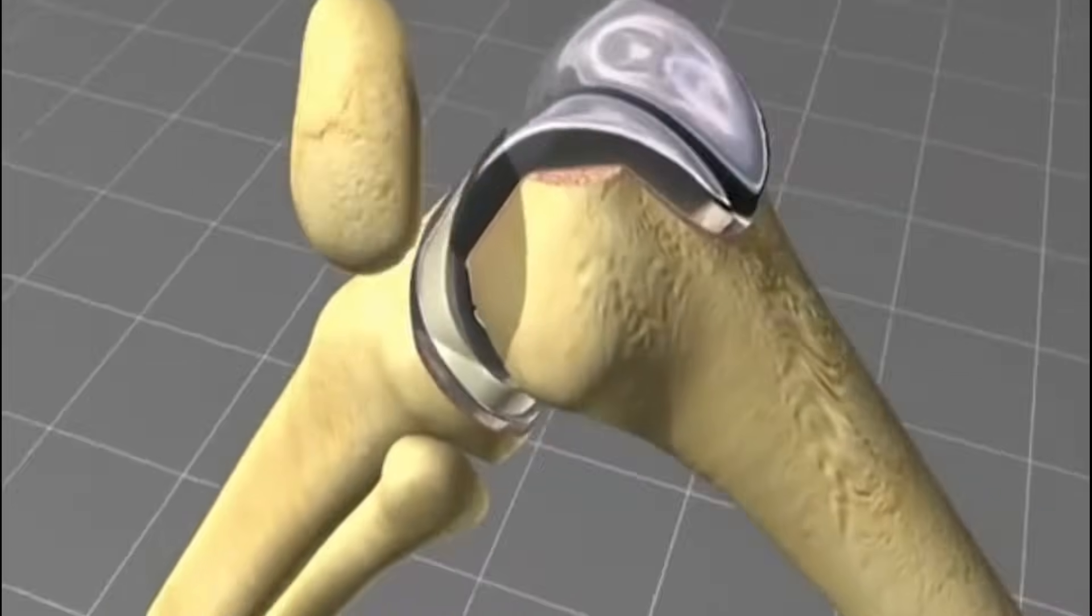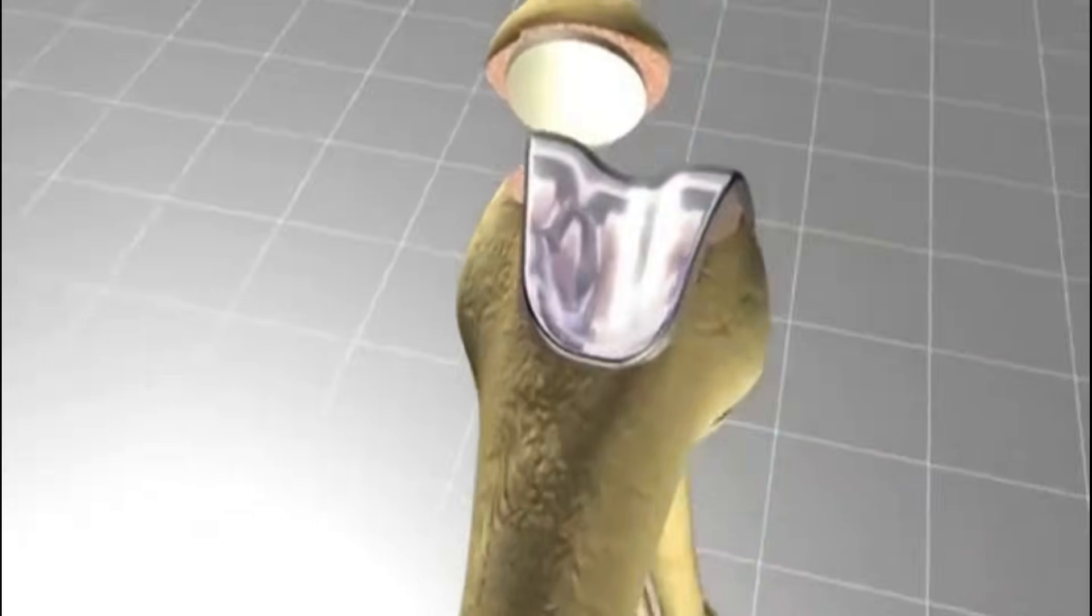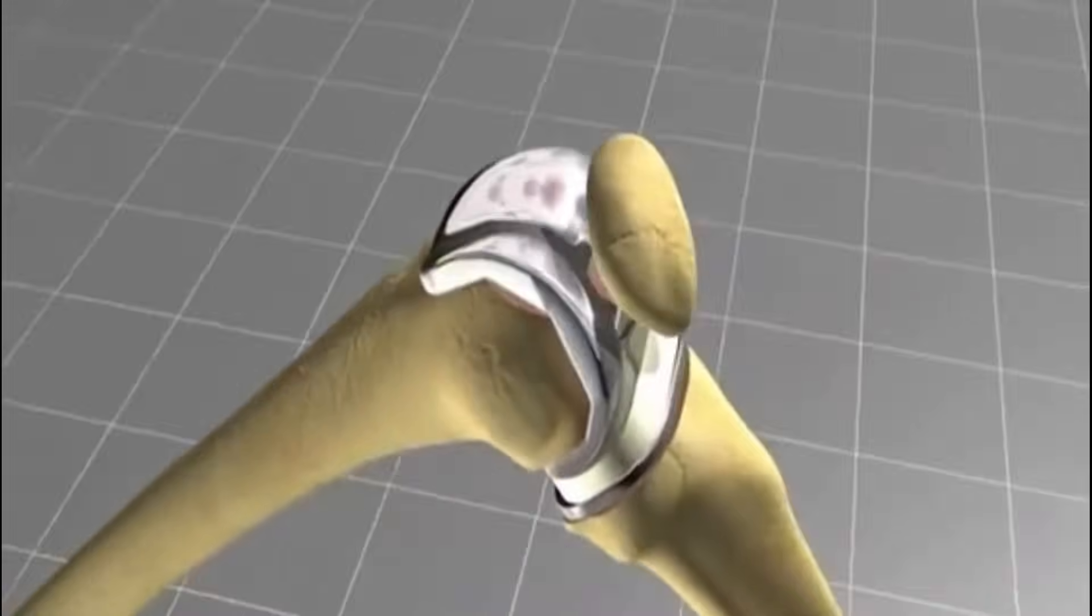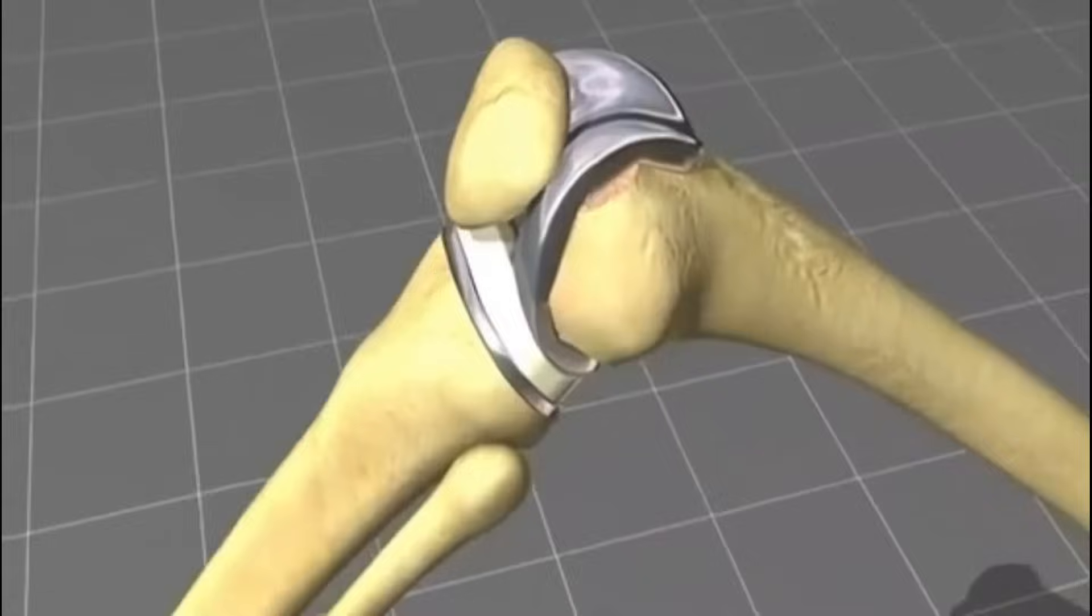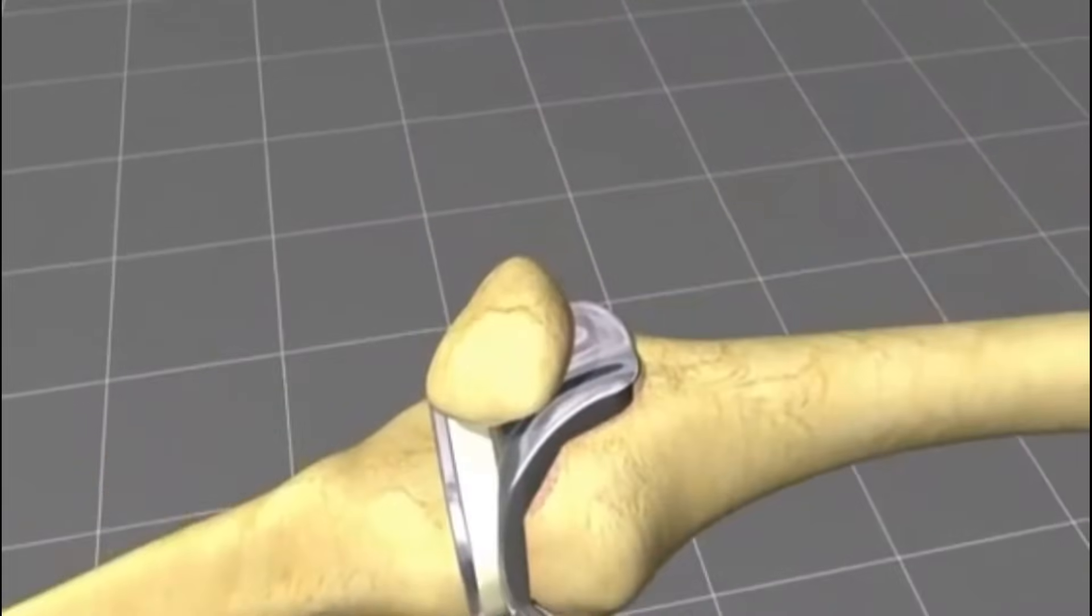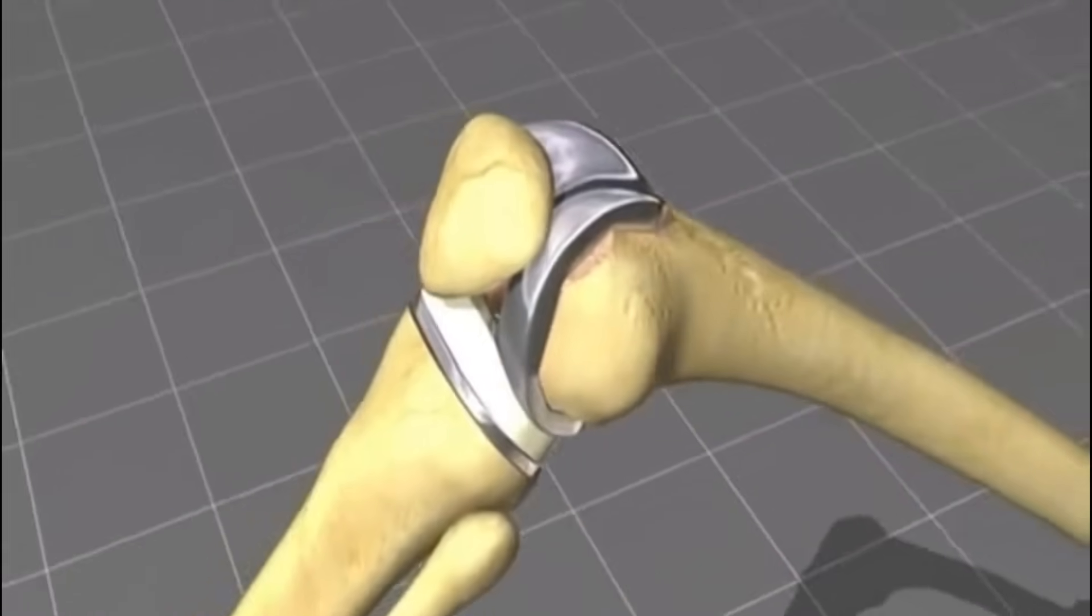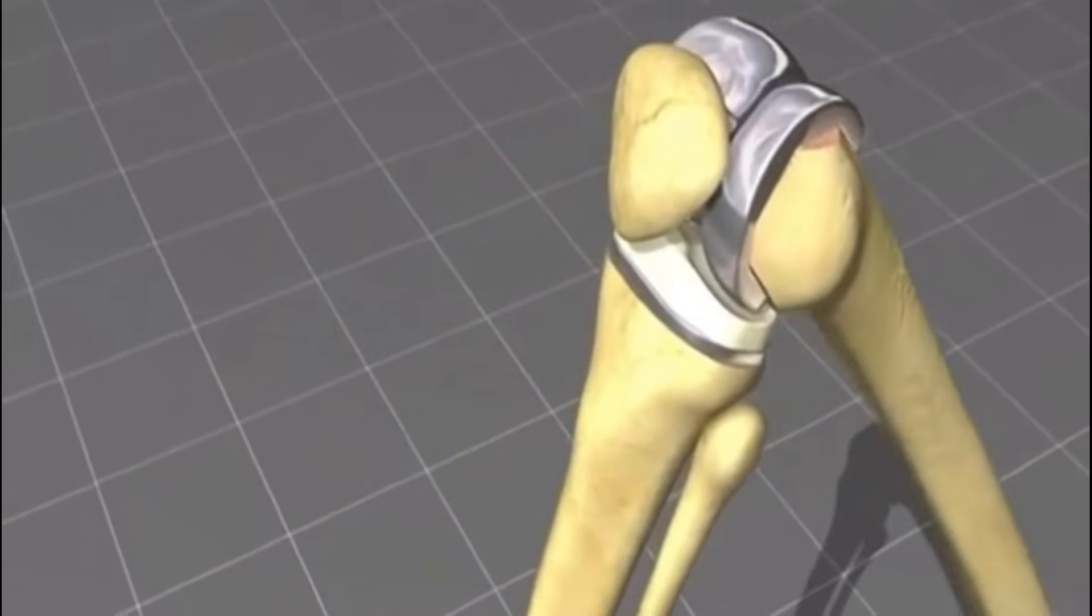An inlay between femur and tibia is positioned which consists of highly stable polyethylene. The kneecap is reduced and the range of motion of the joint is checked once more.